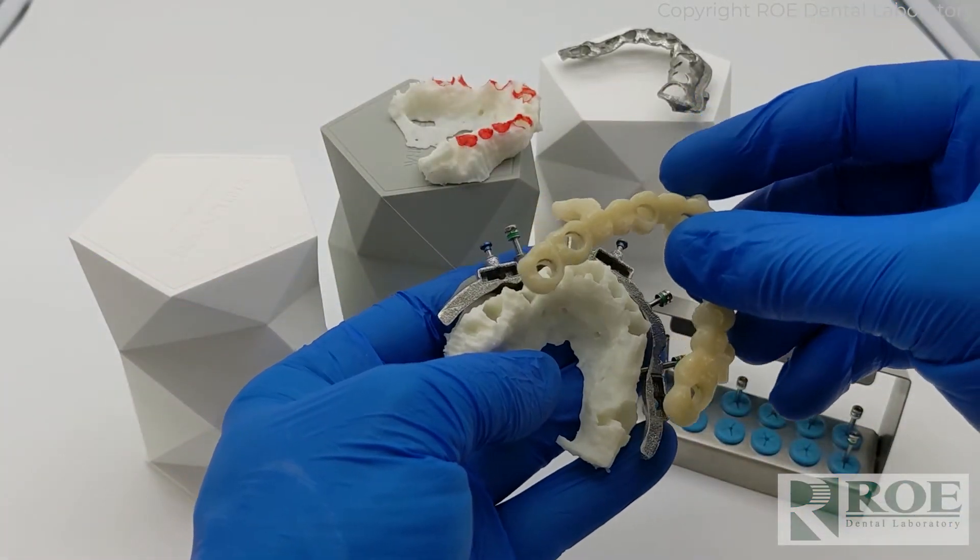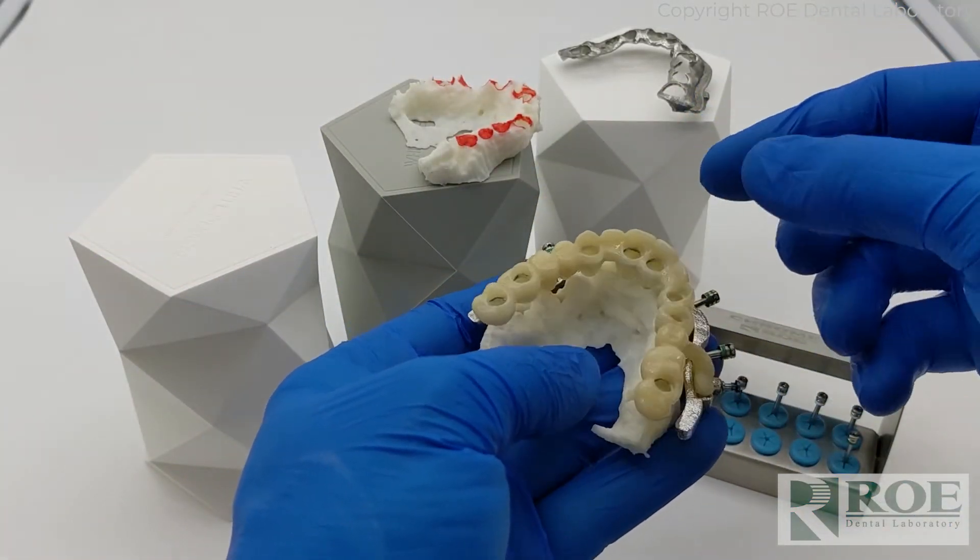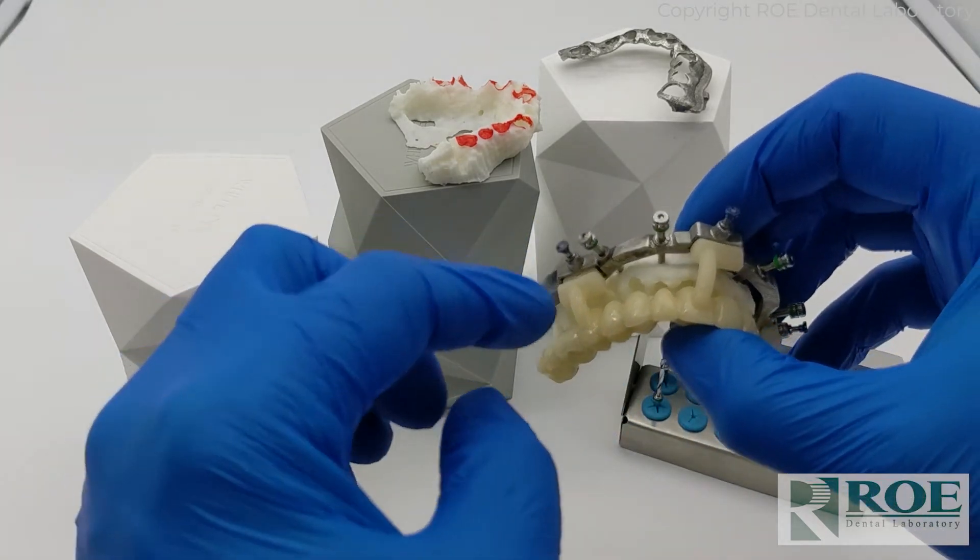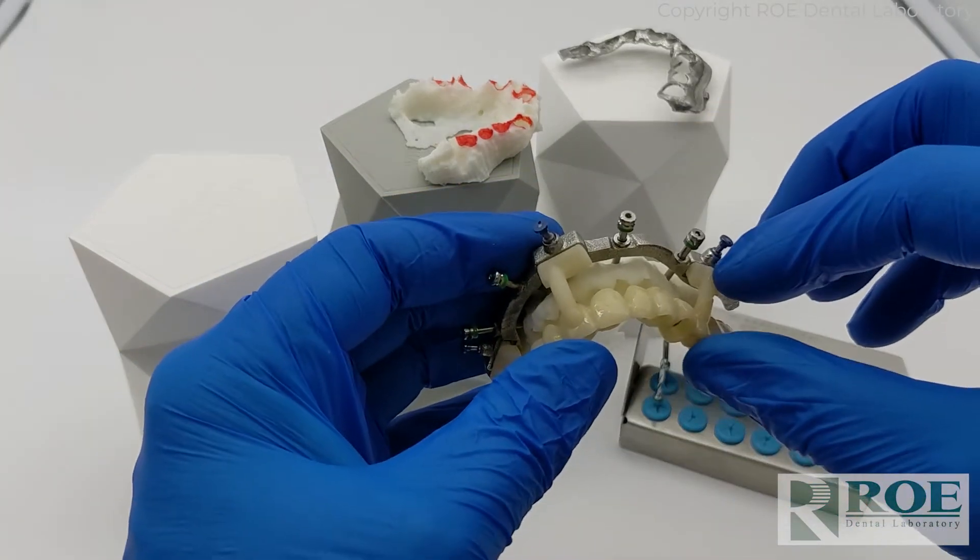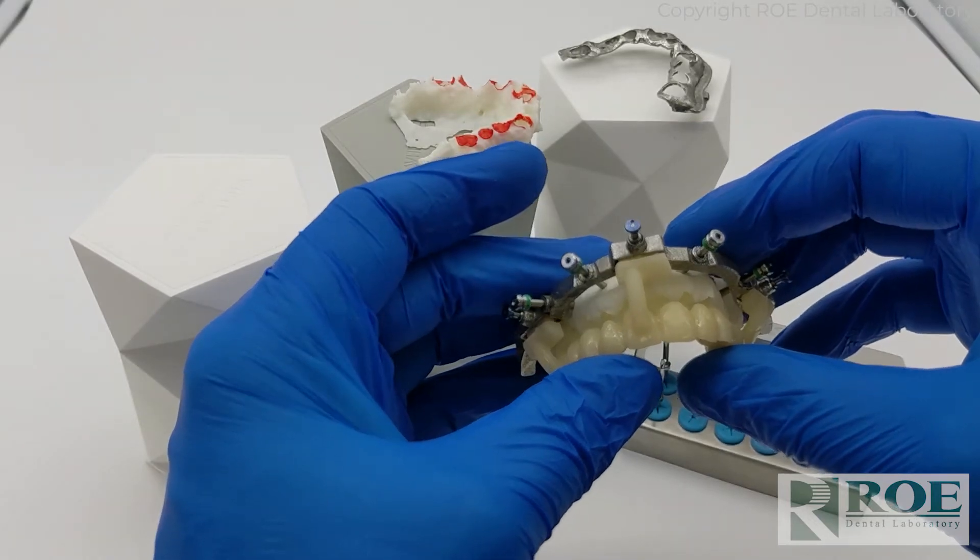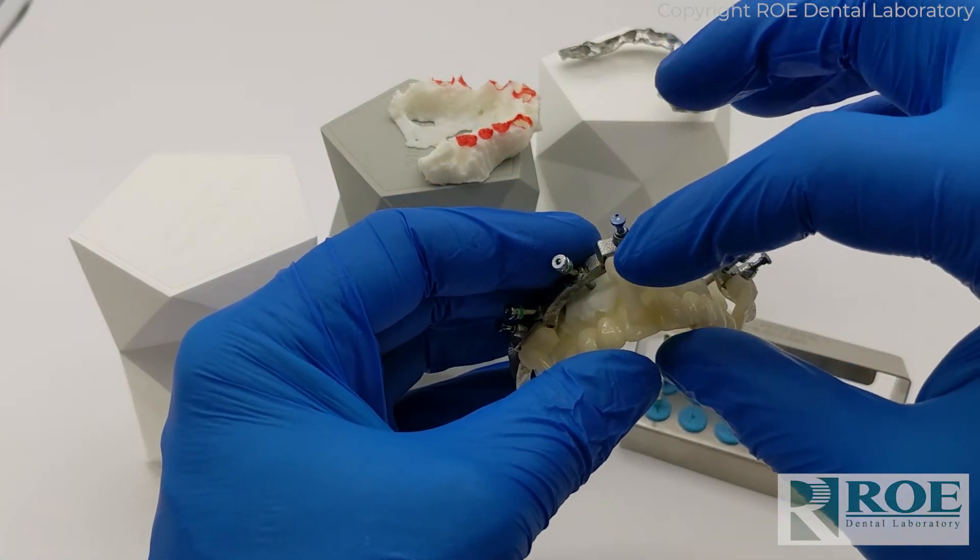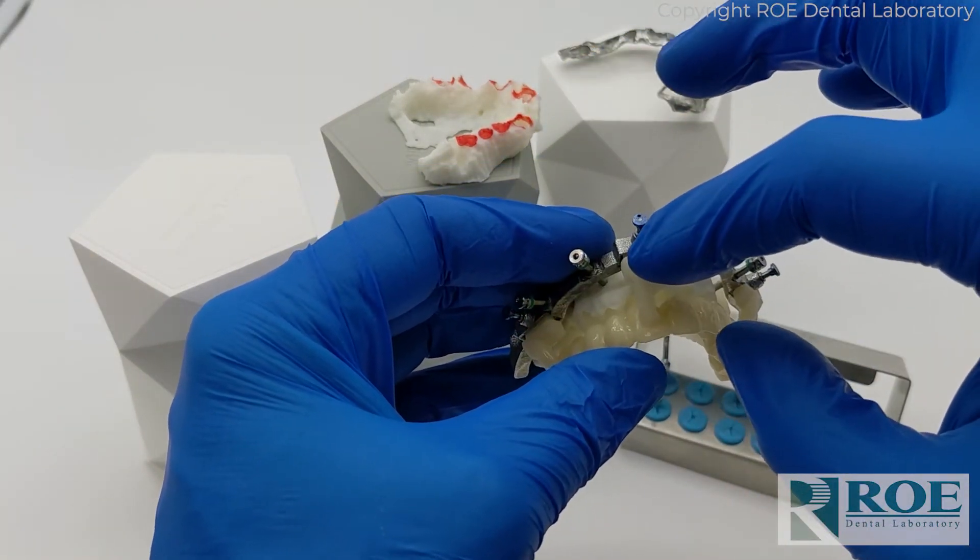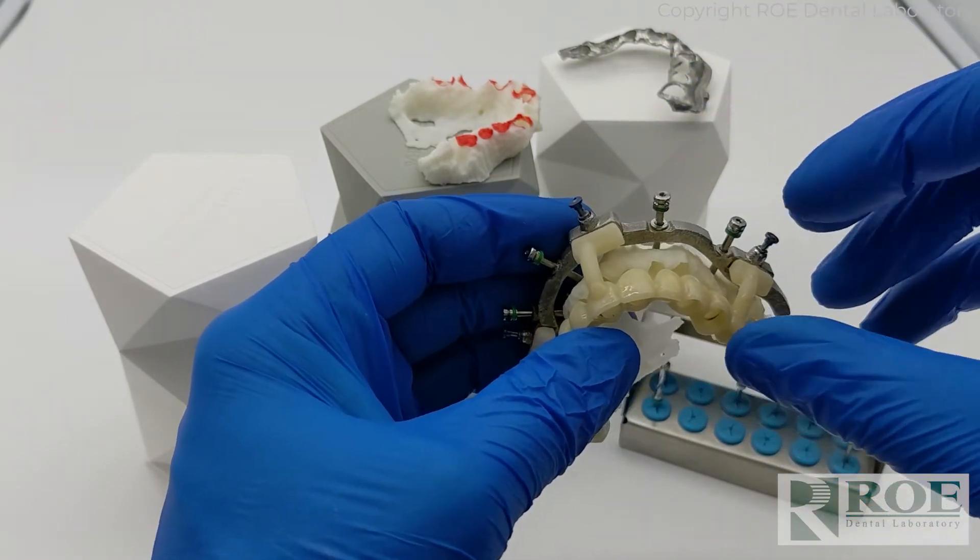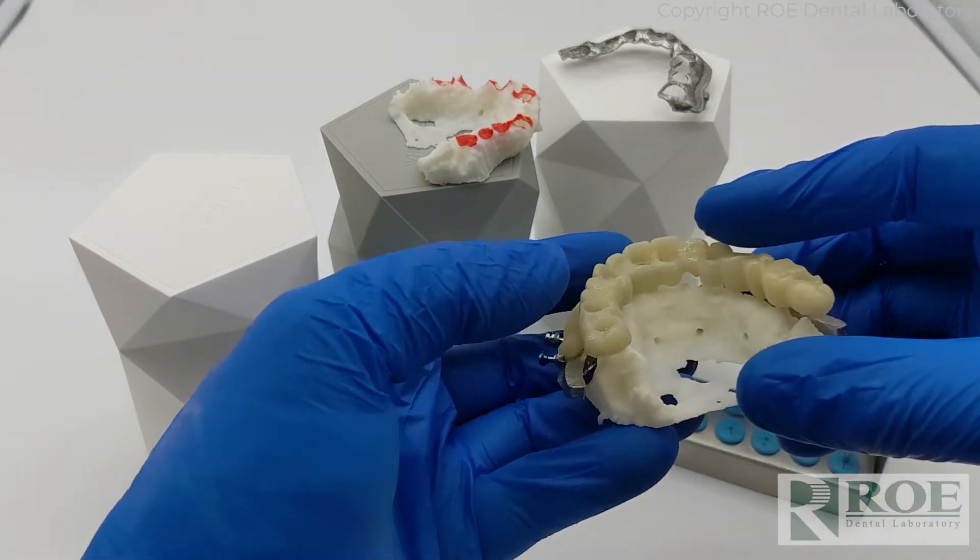It's very important to be careful with these arms in the mouth. If they break off you lose your tripodting. If one breaks off you can still clip them into the other chrome locks, but if you lose one you're going to lose a little bit of the balance that you need to seat these cases.